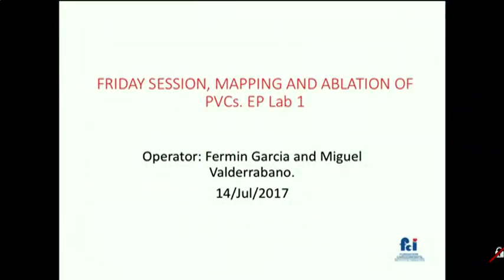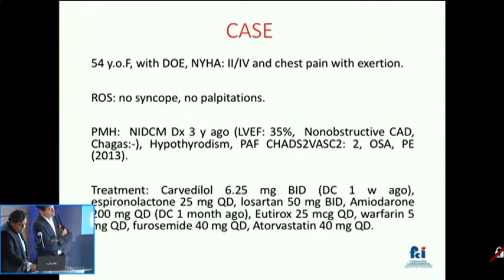The details of the clinical history will be presented now. Good morning. I'm going to present the case.